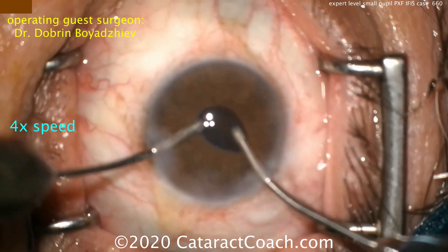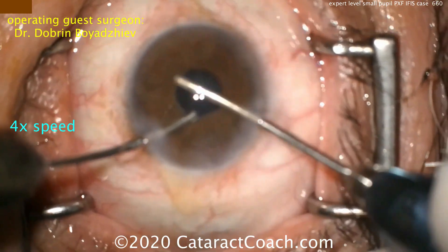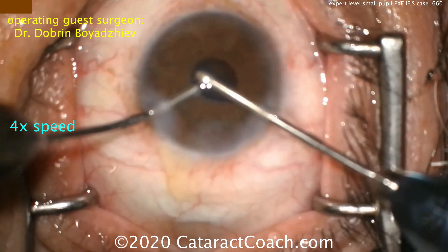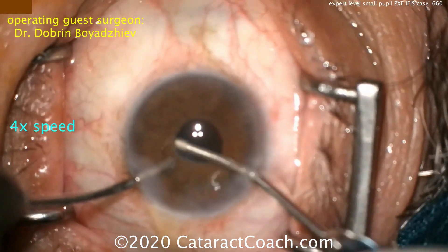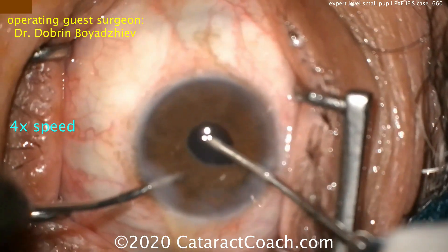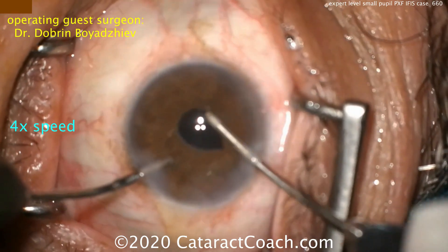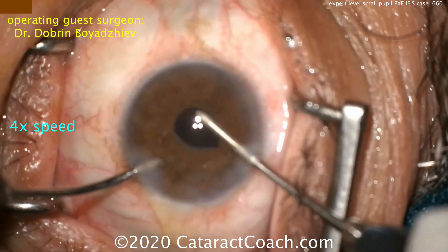It's important at some point to lift up the iris to check underneath it — you've seen this done using a chopper and coaxial infusion. Here, if you're using a bimanual approach, you can use the non-dominant infusion hand to use the infusion probe and lift up the iris as well. We like to show all these different techniques to our surgeons.